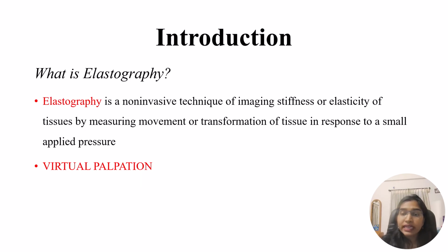So, what is elastography? Elastography is a non-invasive technique of imaging the stiffness or elasticity of tissues by measuring the movement or transformation of tissue in response to a small applied pressure. When we are doing a scan, we can say it is appearing as cystic, it is appearing as hard tissue, but nothing can compare to actual palpation.